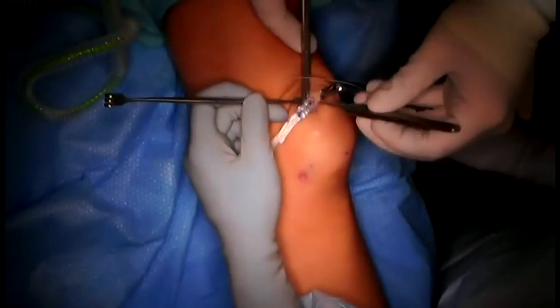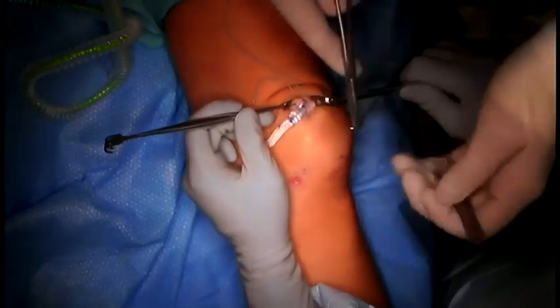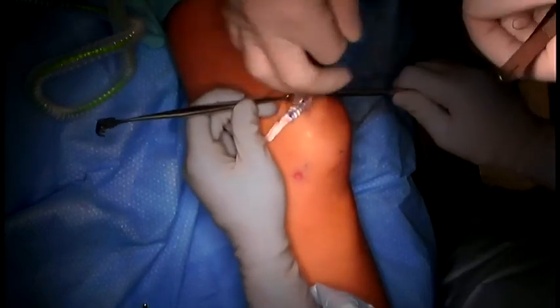The proximal aspect of the slot in the quadriceps tendon is closed using interrupted sutures to prevent propagation of the defect in the quadriceps tendon.